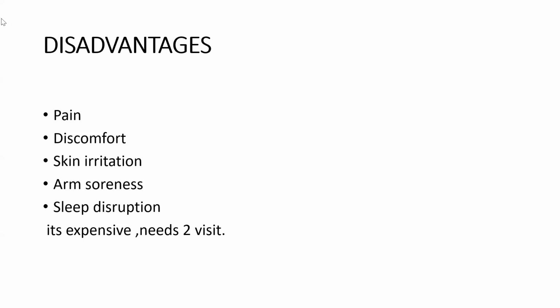So if a patient at night has a 10 to 20% reduction of the daytime blood pressure, that's the normal finding, and they are dippers. Non-dippers are those that do not have up to a 10% reduction of their daytime blood pressure at night, whereas reverse dippers have a nighttime blood pressure that is even higher than the daytime blood pressure.